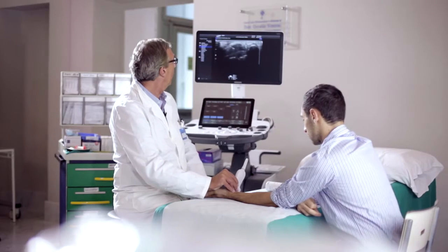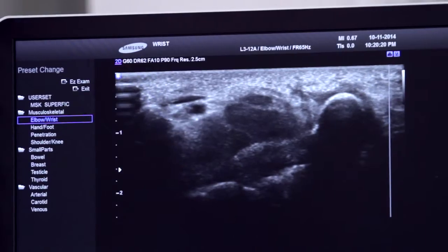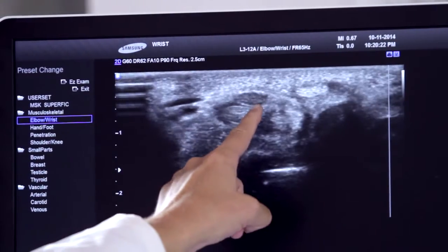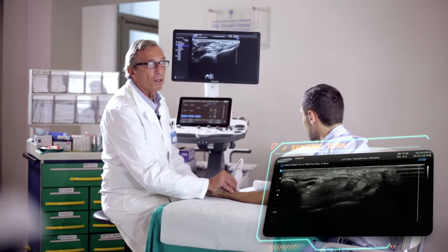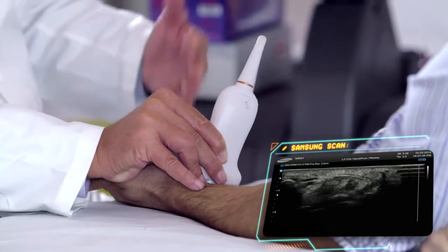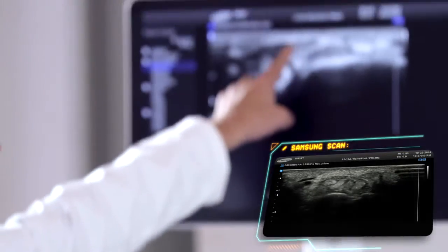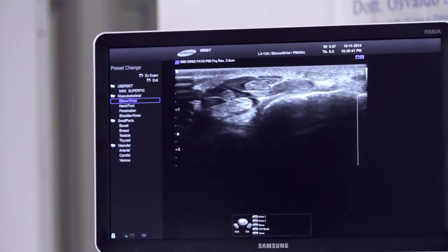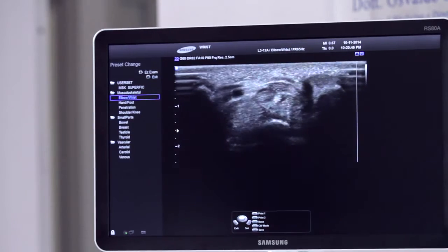This is the proximal part of the carpal canal, where we first identify the most proximal portion of the flexor retinaculum, in which we see the median nerve. The median nerve has the typical characteristic of all nerves, and it is represented as a fascicular structure, whereas tendons normally have a fibrillar structure. It is very well displayed on the short axis scan, and we recognize this characteristic aspect of the peripheral nerve, in this case, the median nerve.